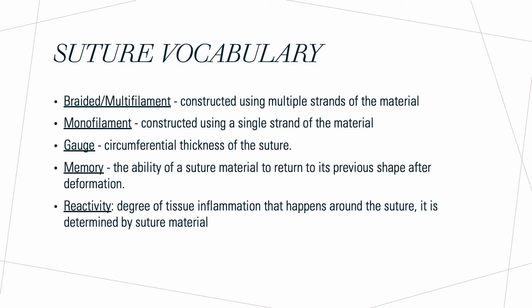Reactivity. This is the degree of tissue inflammation that happens around the suture, and it's determined by the suture type, and we'll talk about this when we're talking about different sutures.